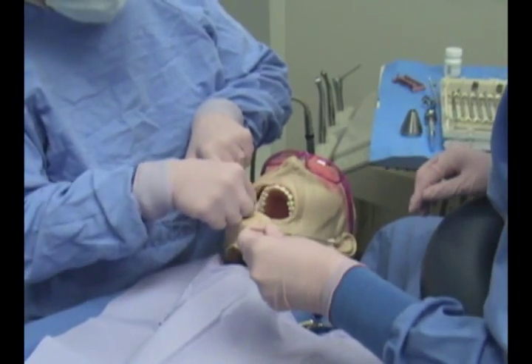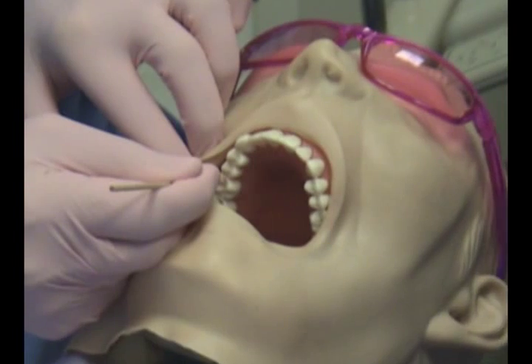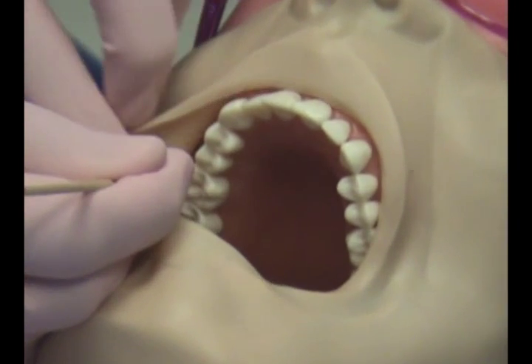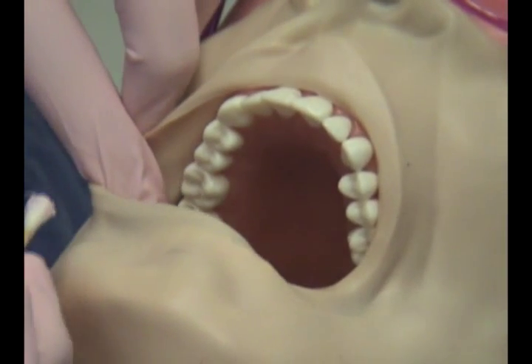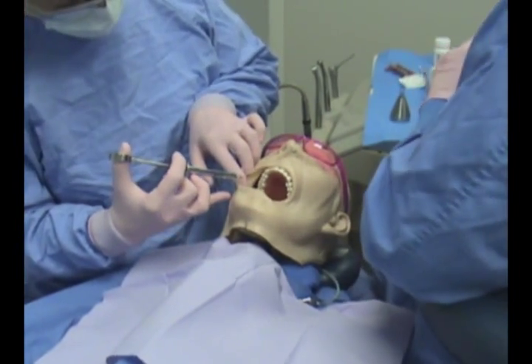The injection site will be dried with a 2x2 gauze. Topical anesthetic is now placed at the injection site. The local anesthetic is now administered to the patient.